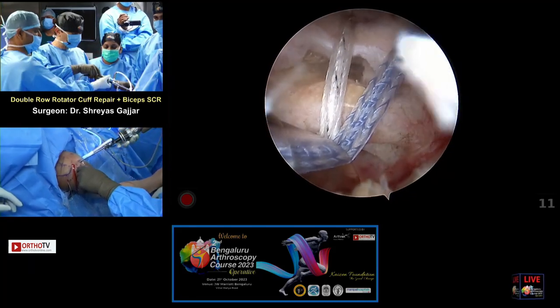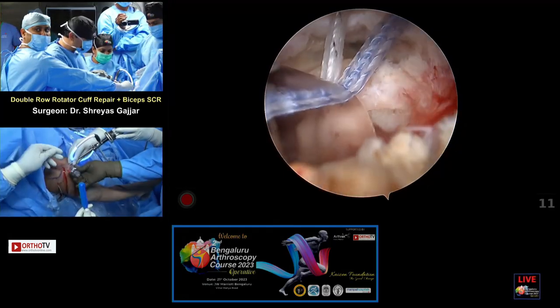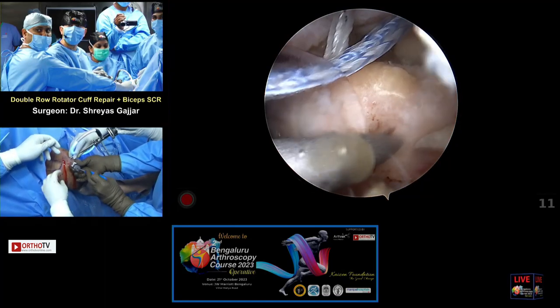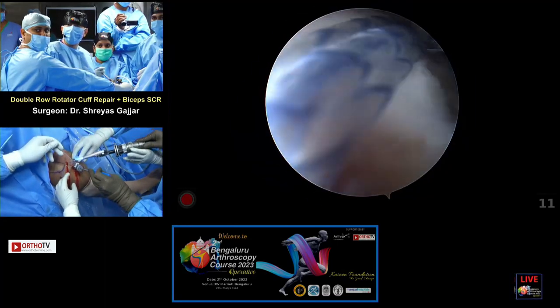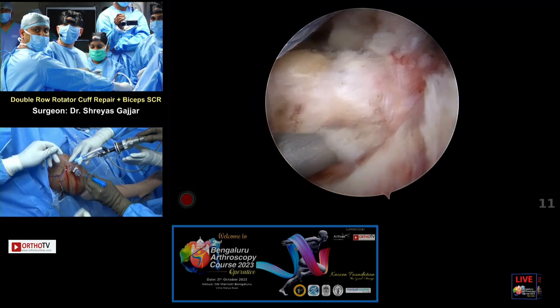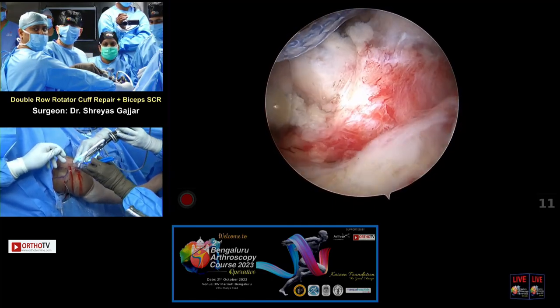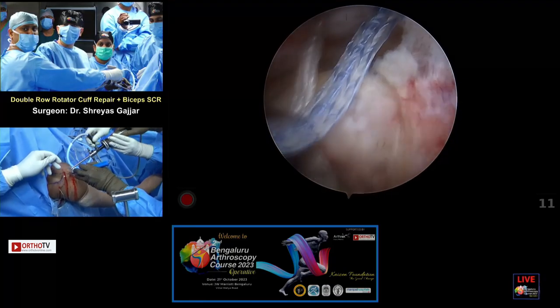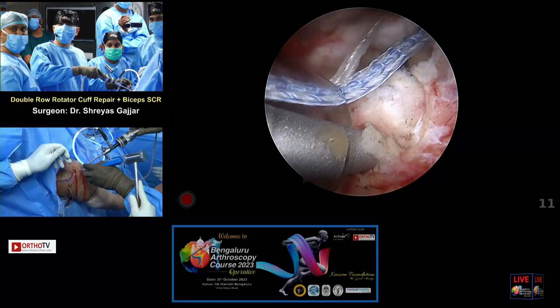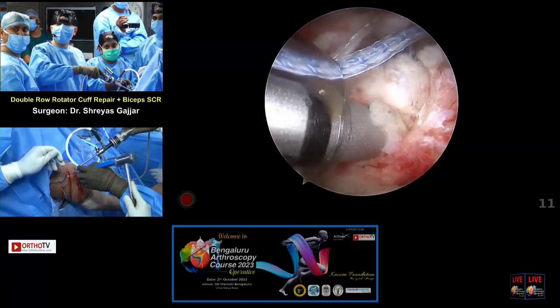Rohit, you hold, please. Punch, please. Akshay, can you hold this up with your left hand and hold the pouch with the right? Thank you. So, I'm happy with this insertion point. Just one second, in line with the tape. Okay, sister, you can hammer. Light source towards you. Hammer, please. Slowly, please. Very slowly. The lateral bone is always softer, so we go a bit slow.